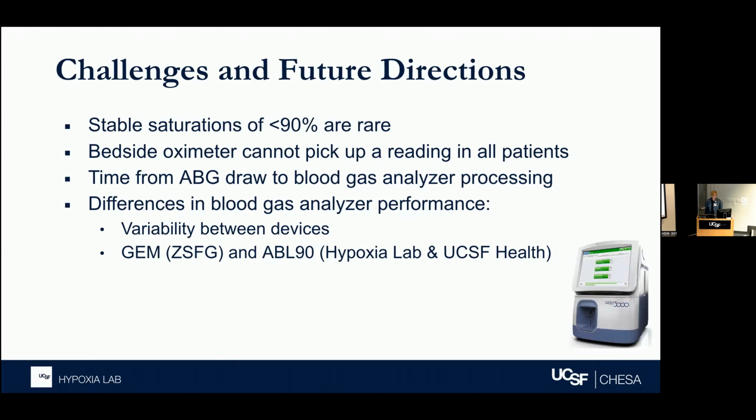Additionally, I think all clinicians are familiar with the problem that the bedside oximeter can't pick up readings in all patients at all times. So we're trying to thoughtfully collect data about those instances when patients do not have a non-invasive reading for us to record, and also to think about how best to analyze those data.